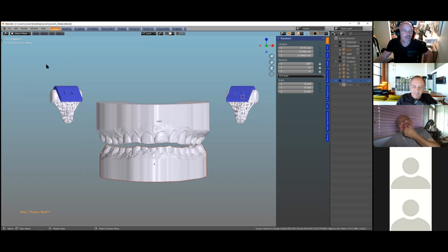Wolfgang, can you hold the floor for a second? You can show us how to install modules.